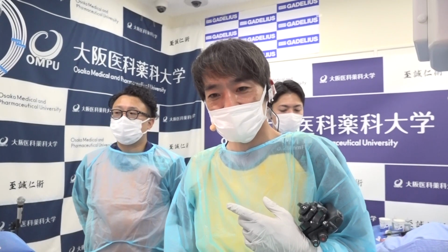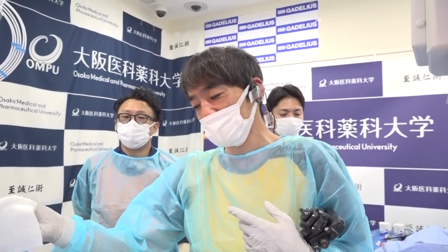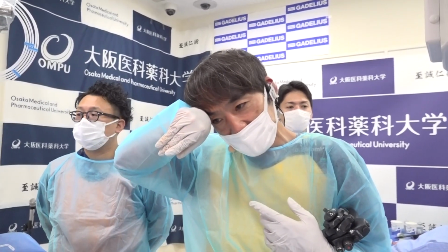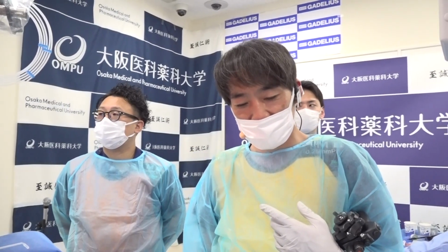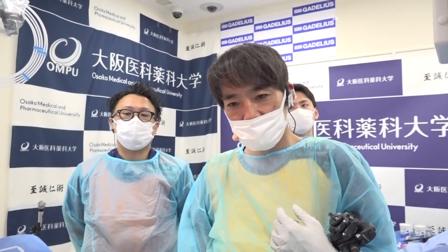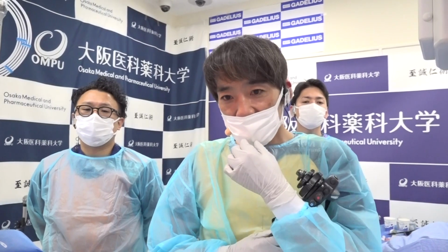Have you had cases of seeding due to spillage? Yes, I have. I think also tumor seeding, risk of tumor seeding. But we have no experience of tumor seeding after EUS HGS before surgery. Yes, we've got one question specifically asking if pancreatitis is a risk in patients where this procedure is performed. Antegrade stenting? Yes.